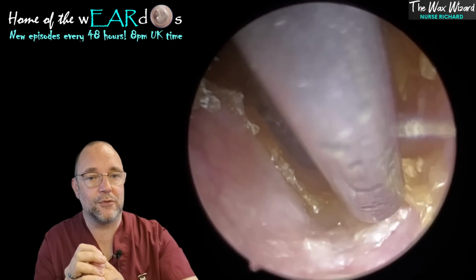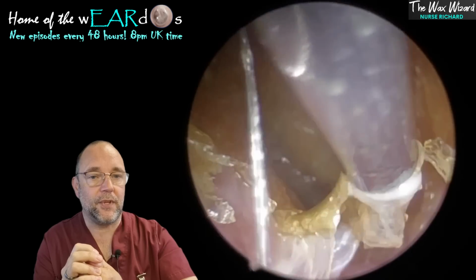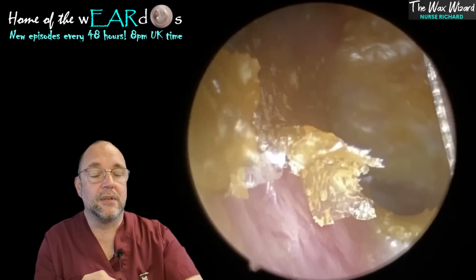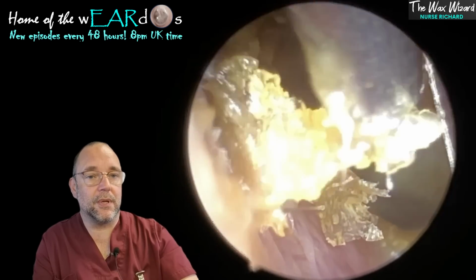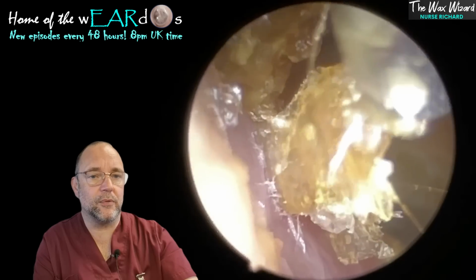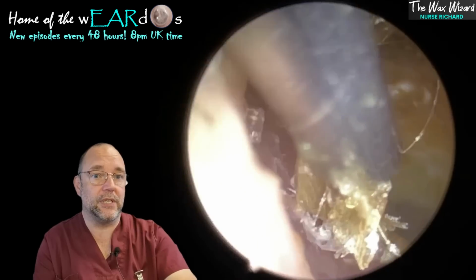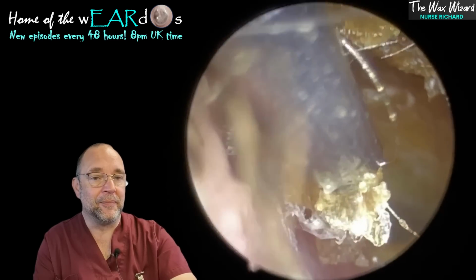So I tend not to advise people to use oil before they come, because on the off chance that it's already wet and sloppy, slimy stuff, which this isn't, it can just turn it into mush. And as you know, those are very difficult to remove as well. So my advice generally is not to bother. If I think it needs oil, I'll use it during the procedure, which is what we did in this gentleman's ear a few times, I seem to remember.